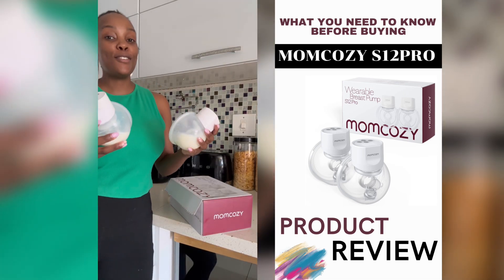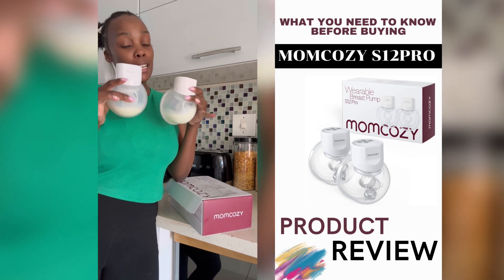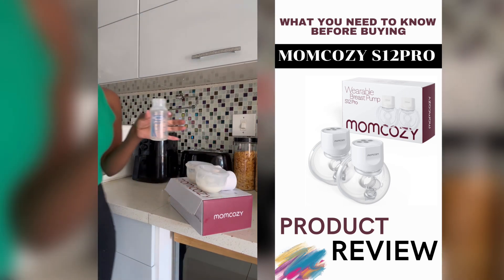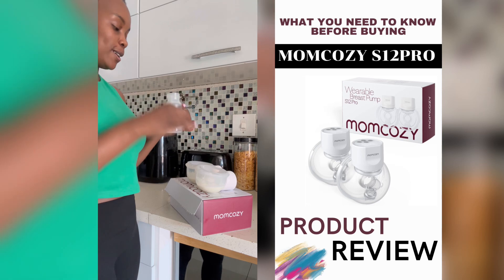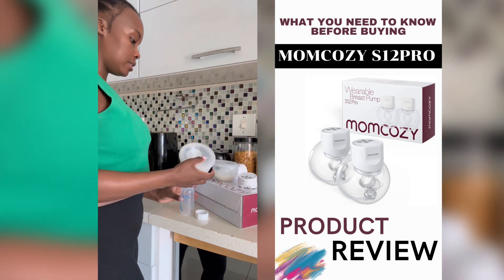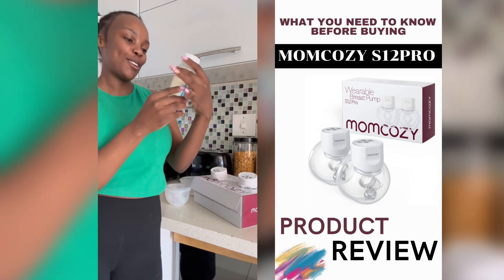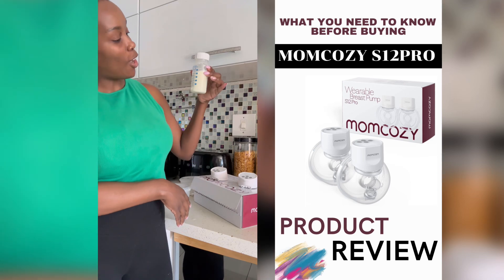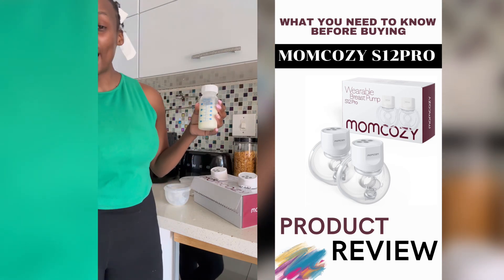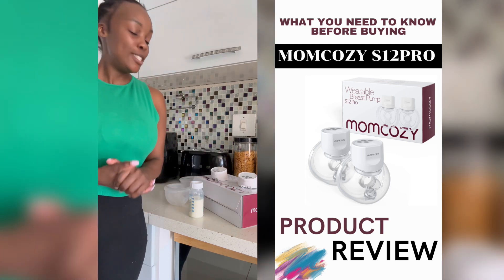I'm literally pumping at very awkward times of the day, but this has been 20 minutes of suction — let's see how much I got. I also got these Dr. Brown bottles from Amazon, which are really cute. And here's the result — 110ml, not too bad at all for a midday session!